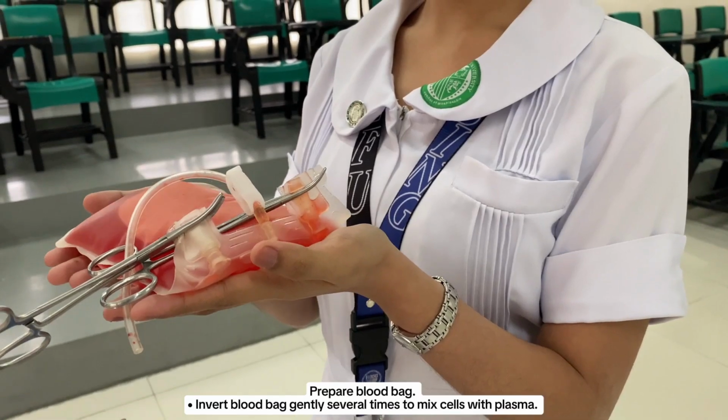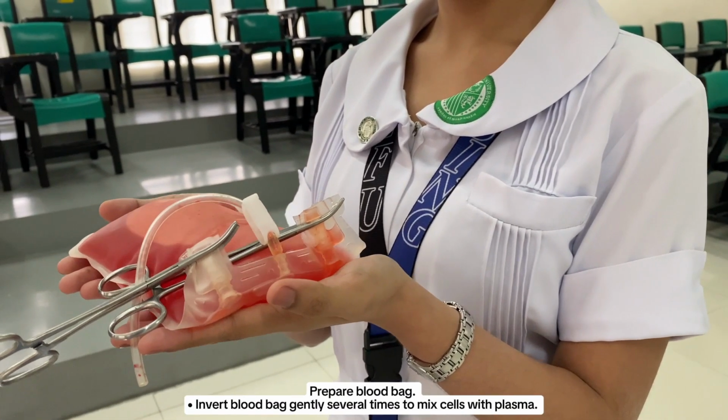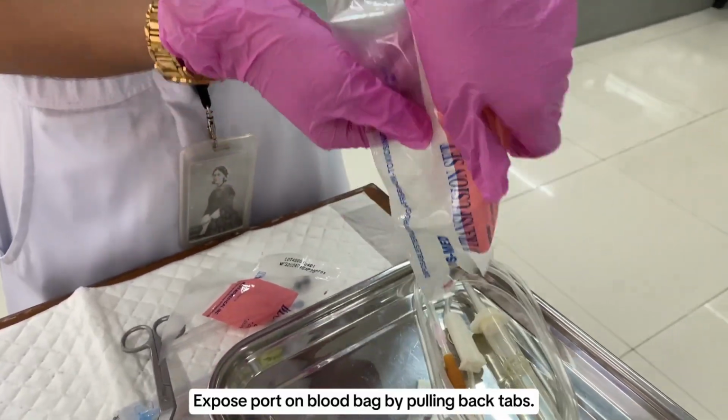Prepare the blood bag. Invert the blood bag gently several times to mix cells with plasma. Expose the port on the blood bag by pulling back the tabs.